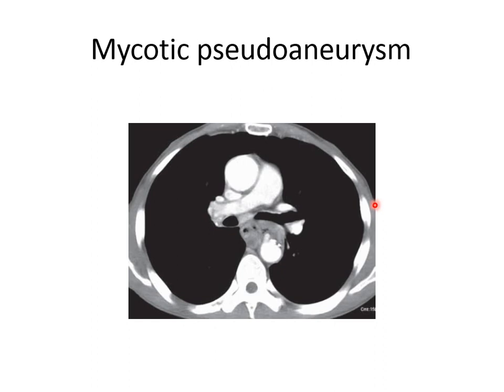Another topic is mycotic pseudoaneurysm. The name is misleading because it is not due to fungal infection. Mycotic means infection causing pseudoaneurysm of the vessels. But it is said to be mycotic because whoever noticed it saw a mushroom-shaped aneurysm in the wall when he discovered it. It is not purely from fungal infection. It's caused by infection, like salmonella, like any other infection.